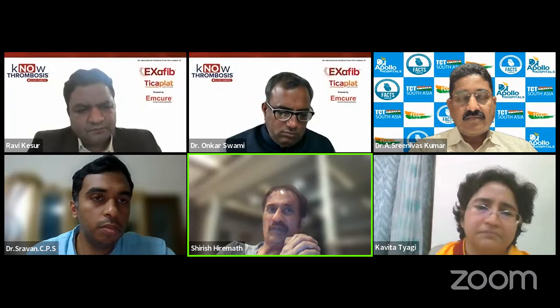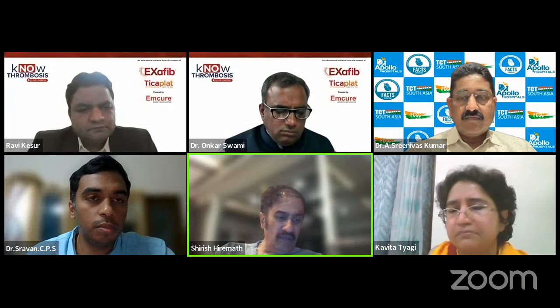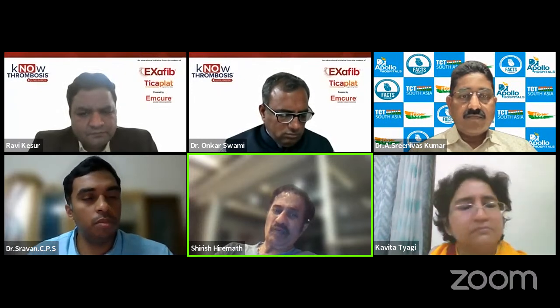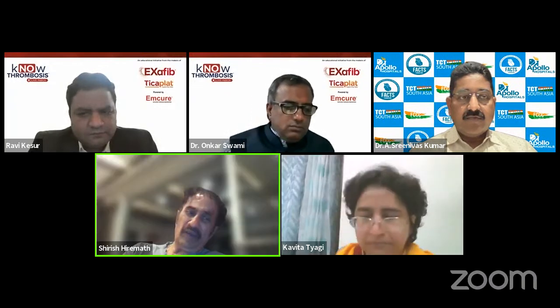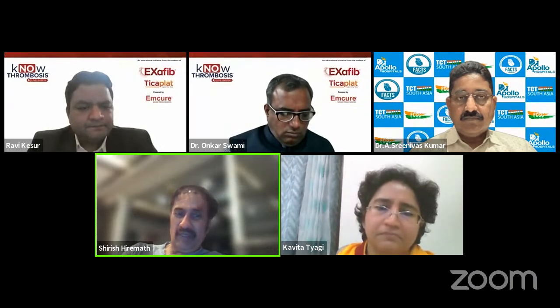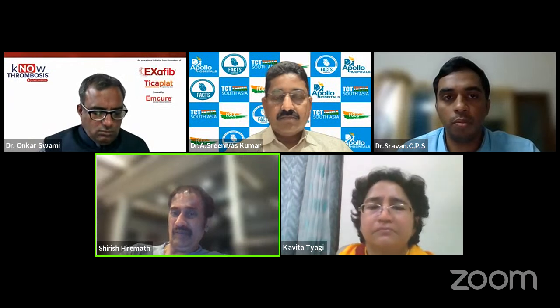People who are focused on peripheral angioplasty should certainly think of IVL. In coronary we know the stent performance is outstanding, but long stents in the SFA have their own negatives. So if you can do without a stent, something like IVL will work well. IVL with a drug balloon might be a good combination.